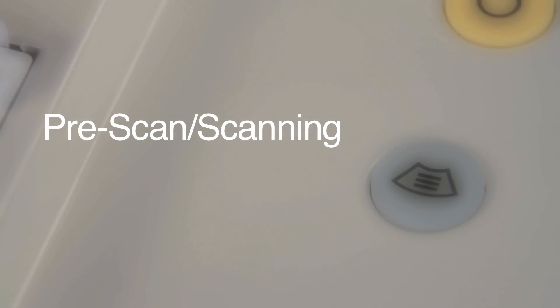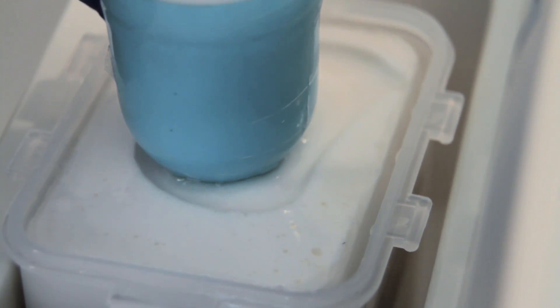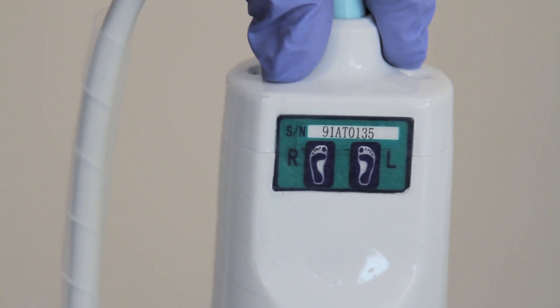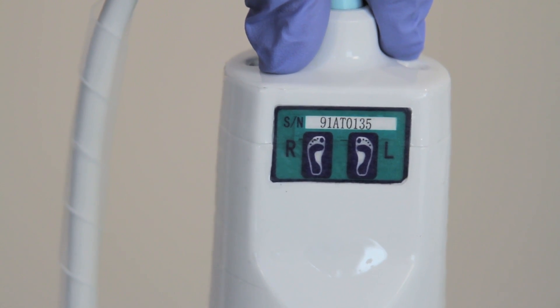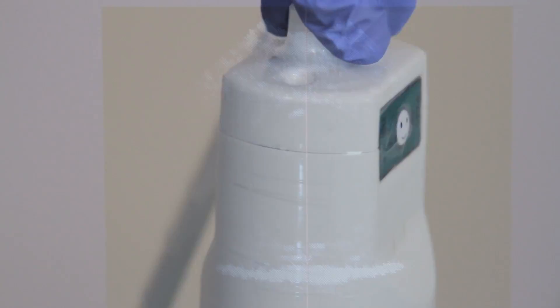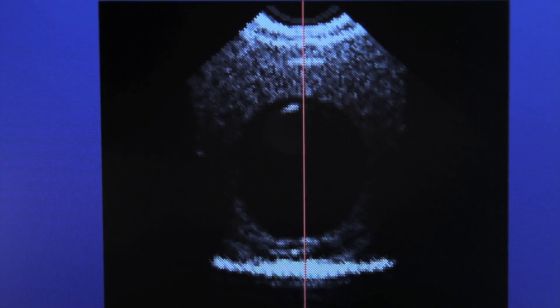You are now ready to scan. Press the Scan key on the control panel to enter the pre-scan screen. Place the probe on the phantom bladder to see a real-time image on the pre-scan screen. When working on a patient, make sure the probe is correctly placed with the feet on the probe oriented towards the patient's feet and the face oriented to the patient's head.